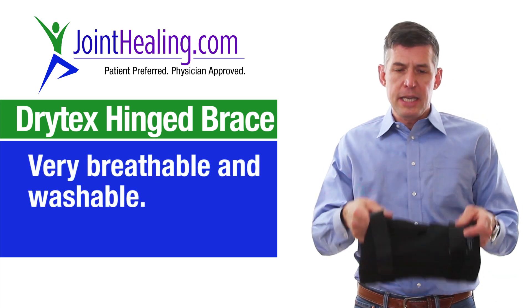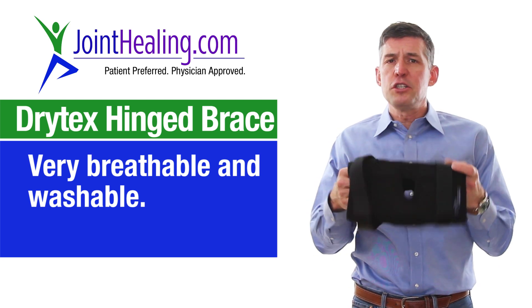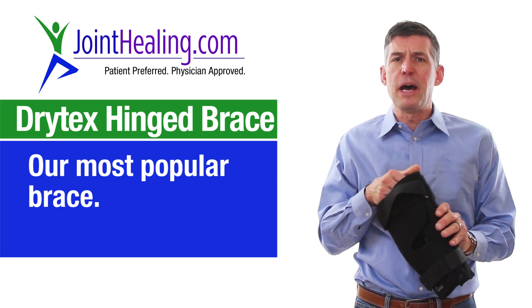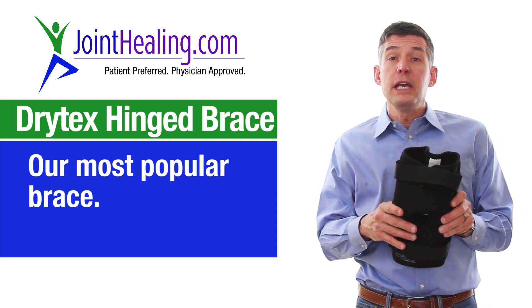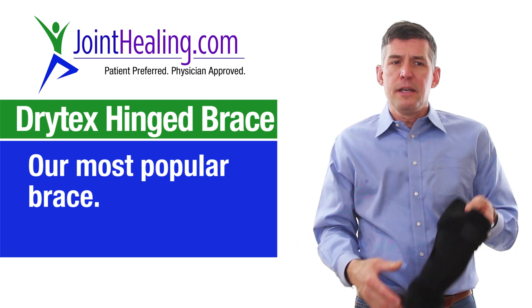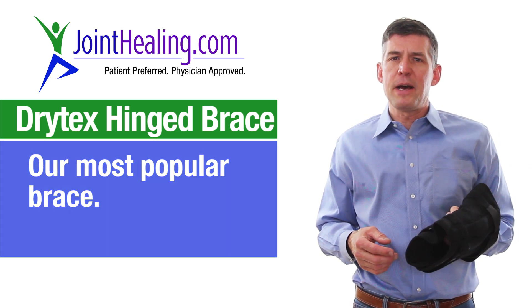This material is very breathable and it's washable — this is why it's our most popular brace. It treats anything from a mild sprain to even a full tear of your anterior cruciate ligament. And right now we have it at our best price. We hope that you stop by again at www.jointhealing.com.